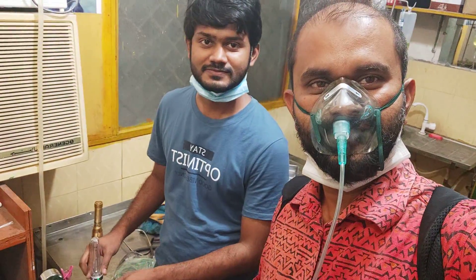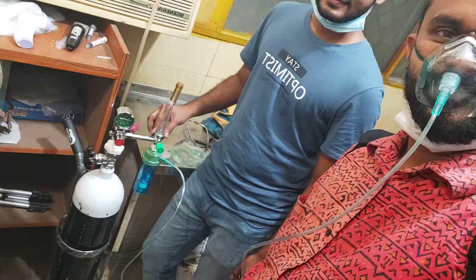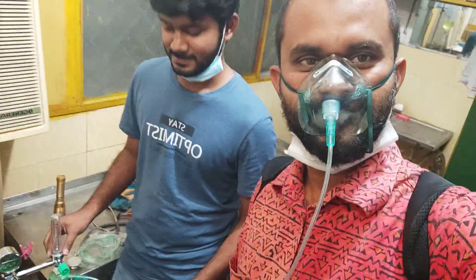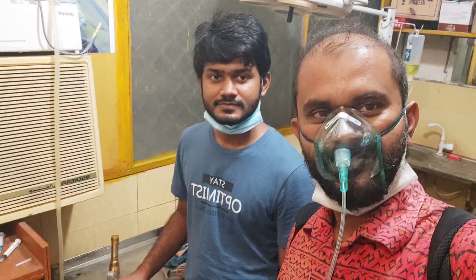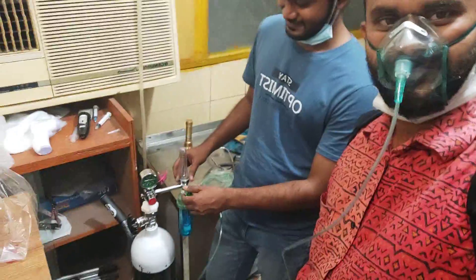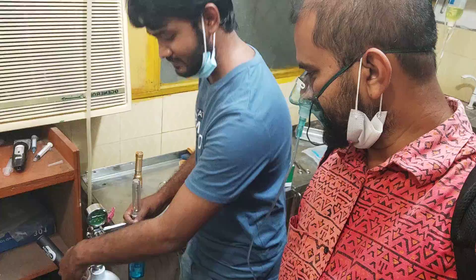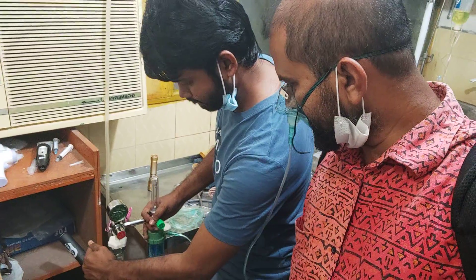Hello viewers, Assalamualaikum. I'm going to introduce the NMLR Oxygen Cylinder. I'm going to start the NMLR. Bismillah.